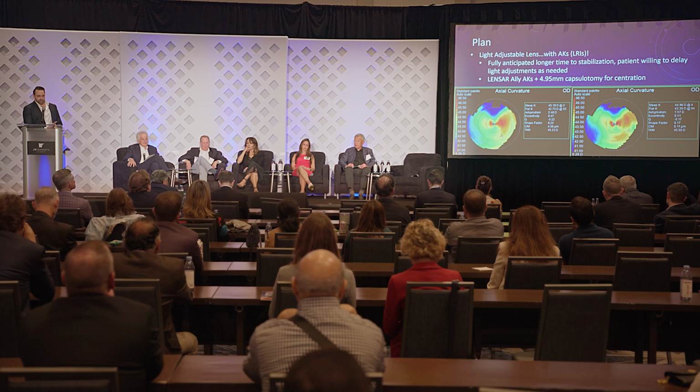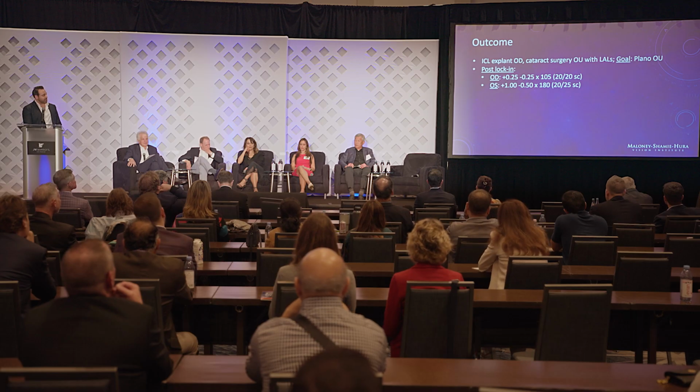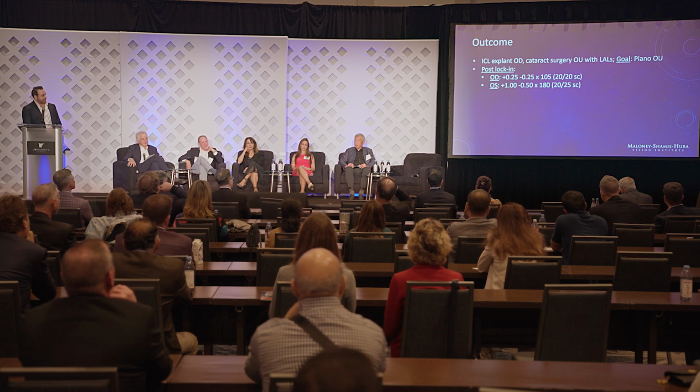He was fine. I mentioned in advance we may have to wait a little bit longer for that refractive stability because we're making that AK. Used a 4.9 millimeter capsulotomy. I just saw him back after a couple years for a YAG, but he ended up +1/4, -1/4 in that right eye. He had a little hyperopic shift post lock-in in the left eye, but wasn't too bothered by that.